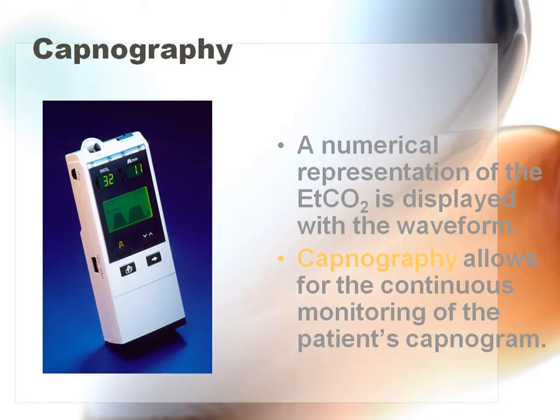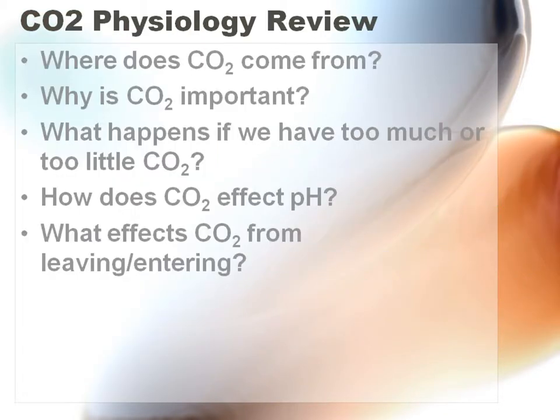This came out probably about 8 years ago. I want to say about 8 years ago. And all this actually came from a bunch of anesthesiologists, because they've been using it all the time. So they started watching these waves, and they said, well, can we decipher anything out of these waves, or is any of this useful? So they started doing a lot of research, and that's where a lot of this comes from. So they took this and said, well, what if you guys could do it out in the field? Because that's one of the ways we're verifying this, and so we've got all these waves and patterns that we've identified. Take this, apply it there, so you can tell when you're intubated or not.